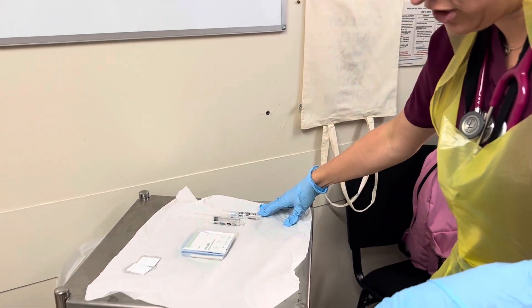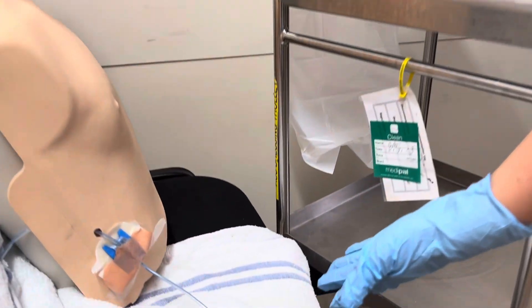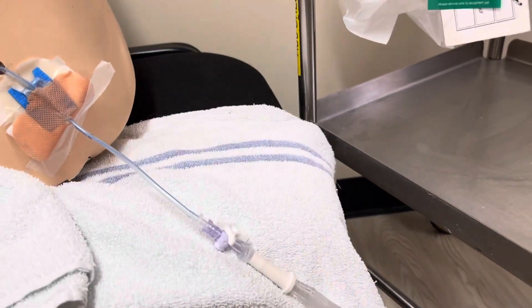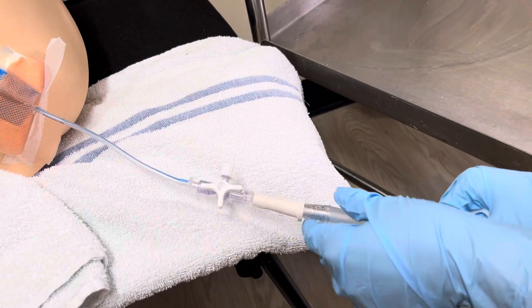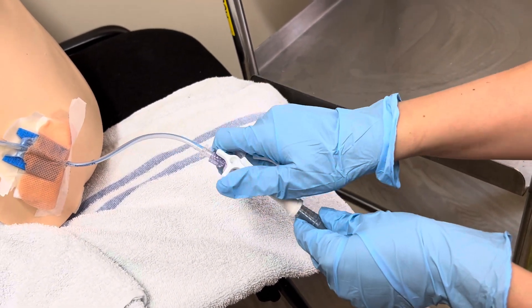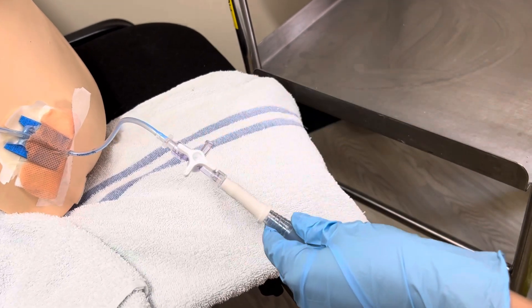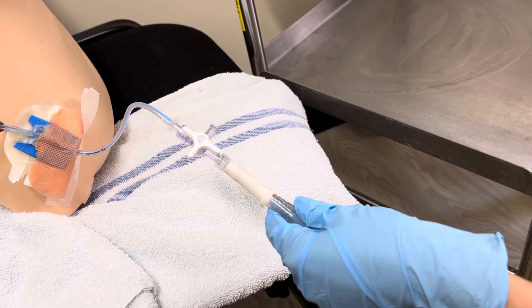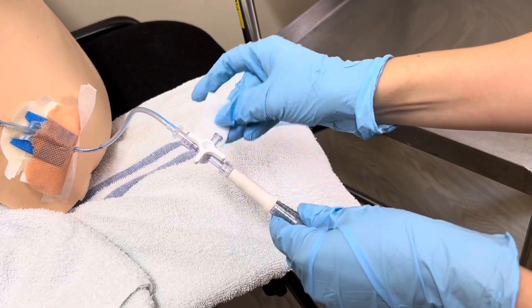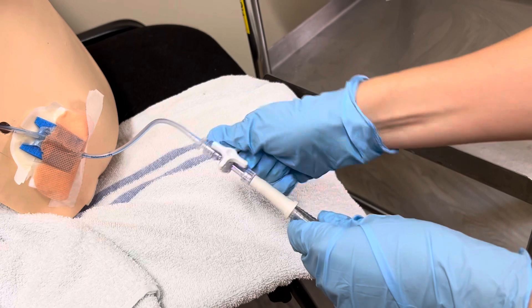Go up to the patient and make sure the three-way tap is accessible. You want to ensure it is closed to the bung — as you can see, there are no arrows showing, confirming it's closed to the bung. Remove the bung and place it on your sterile field, then take the wipe and rub the area for a full 30 seconds.